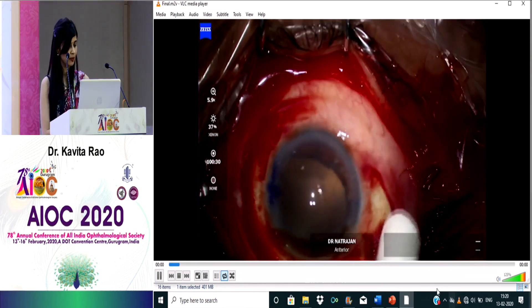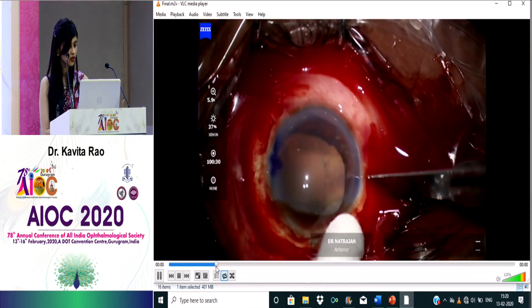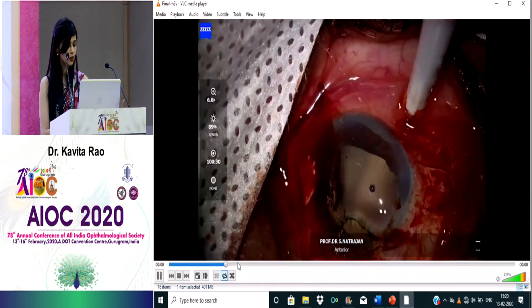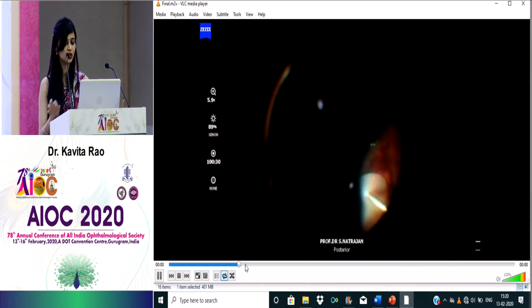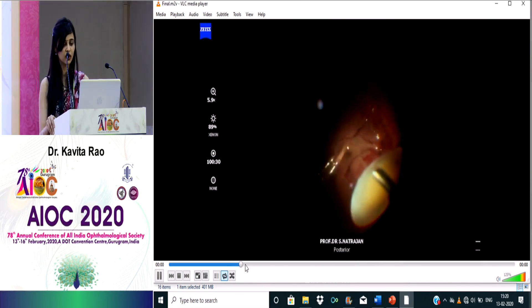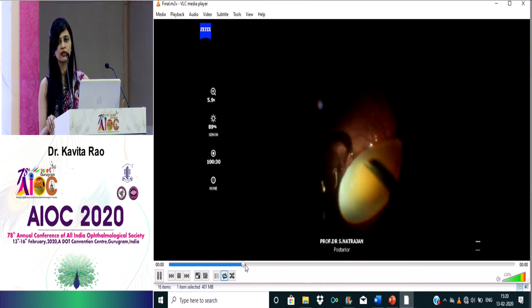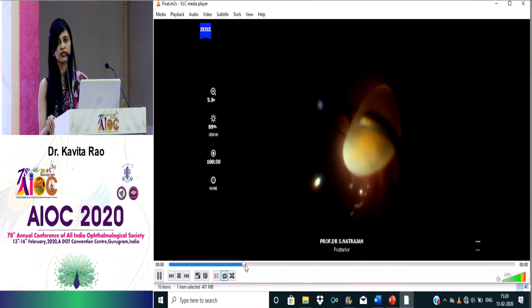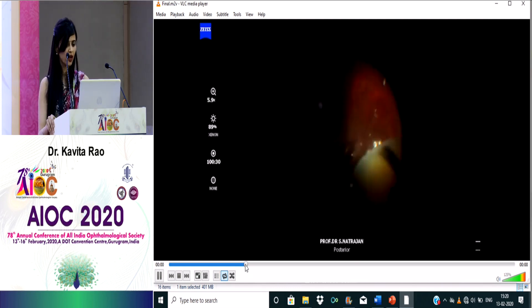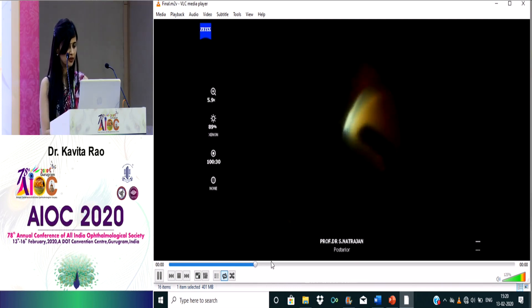I've made the flaps already. Here the surgeon is now doing the vitrectomy. As you can see, the entire cataractous lens is in the vitreous. He decided he can manage this — sometimes if it's really hard, he delivers it to the anterior chamber. But he felt he could proceed with phaco-fragmentation of the entire nucleus.